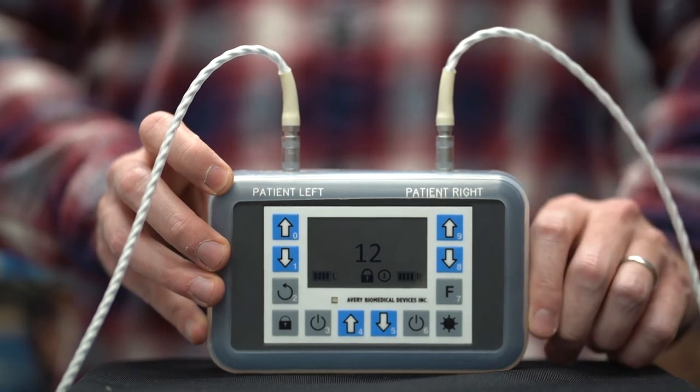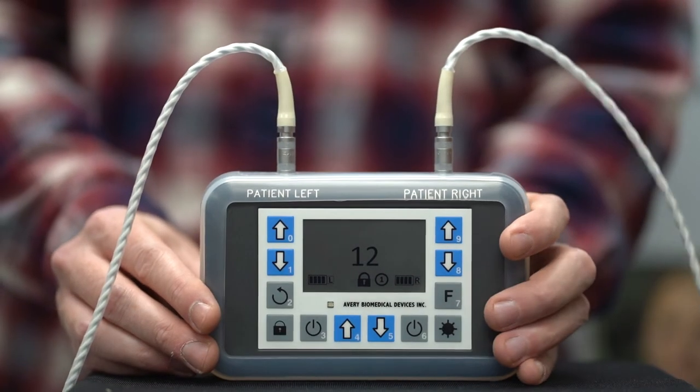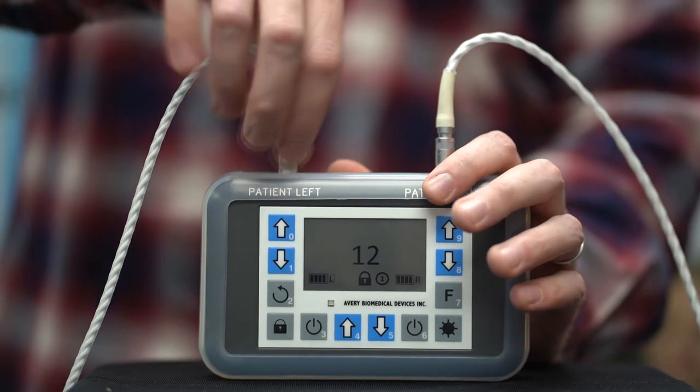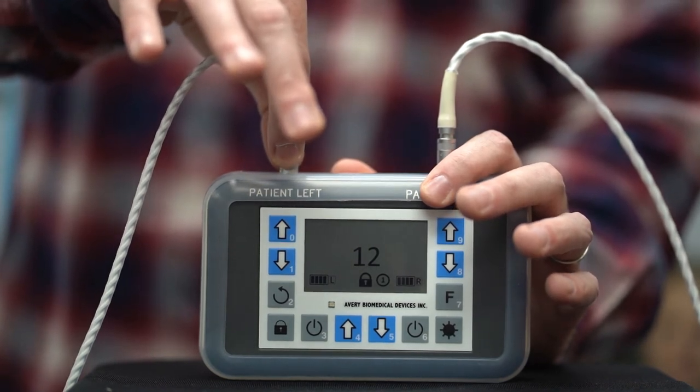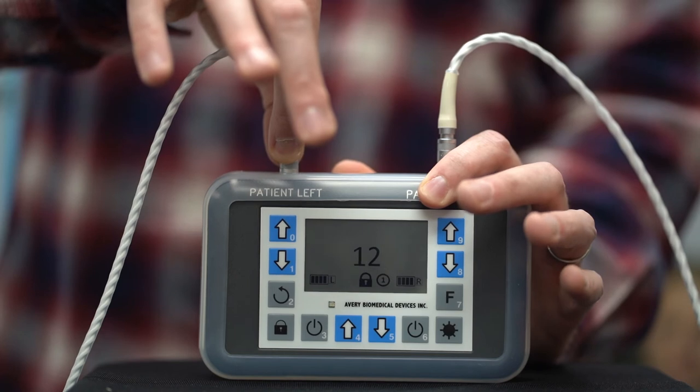To remove antennas when the spirit is not in use, turn the device off and firmly hold the spirit with one hand. Grasp the antenna only by the rough collar or barrel of the metal plug. Holding the connector, pull it straight out.